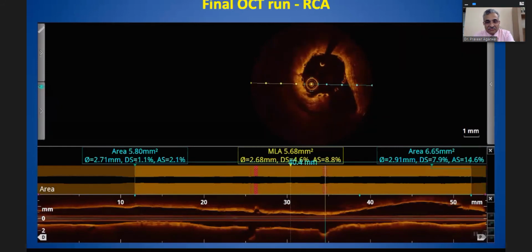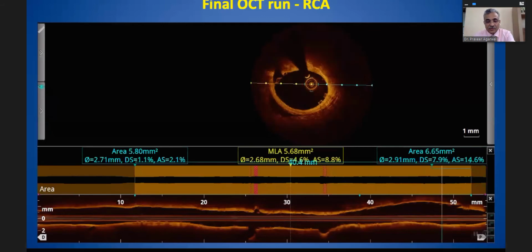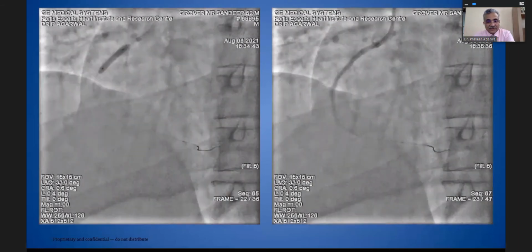Here and there you can see mild malapposition, very, very minimal. So with this scaffold, there's a quarter size over balloon, which is already provided with that. So after doing this, we just took a 3.25 balloon and went high pressure, and that's the end result of that.